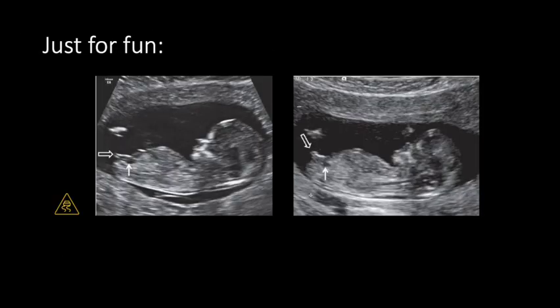While not necessary to complete a limited second or third trimester ultrasound, one of the most commonly asked questions when I do these ultrasounds is from moms: can you tell if my baby's a boy or a girl? While this is less common now that we have cell-free DNA testing that helps us determine the gender with greater accuracy and earlier in the development of a fetus, this is still a fun and useful skill to have, especially if you're in an area where you don't have access to advanced testing like fetal DNA testing.